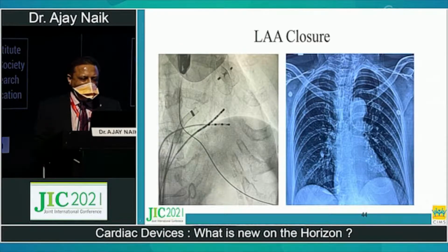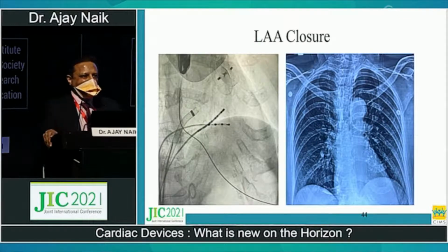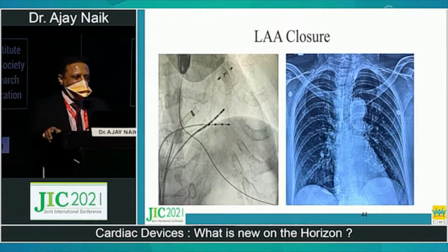That is deployed and the sheath is taken out. In this X-ray, you can barely see it. It's like two spots here, LA appendage. So this is the advancements in cardiac devices over the past few years, and we are already doing it at CIMS. Thank you very much.